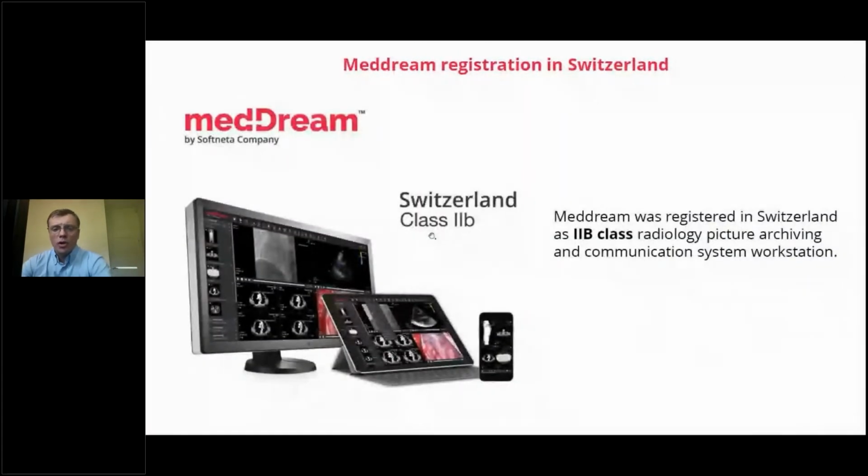Another big piece of work which we did, we actually started last year, but because it was totally new, manufacturers need to recertify their products in Switzerland. It took time for us to pass all examinations and provide all documentation, but we have passed everything, and now our product is also registered in Switzerland as a class 2B, like in all of Europe.